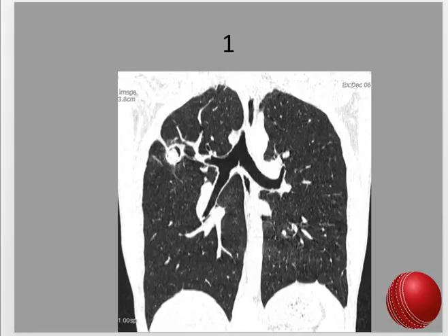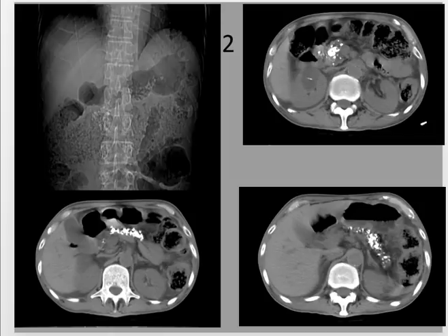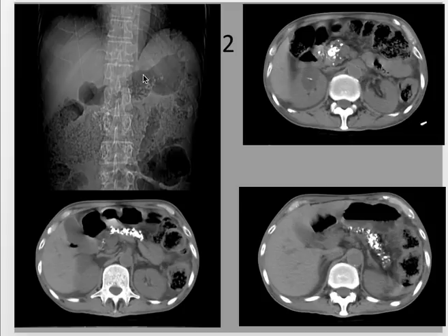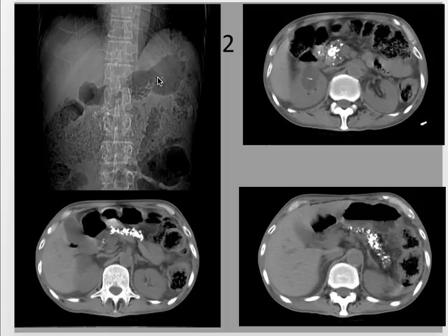So this is a classic case of aspergilloma. Coming to the second case: these are the topograms of the upper abdomen. You can see clearly the bowel gas here — this is the stomach taking the shape of the stomach gas, and this is the large bowel with fecal content. There are multiple tiny radiopaque shadows in the shape of the pancreas, located in the epigastrium. So there are multiple calcific foci within the pancreas.